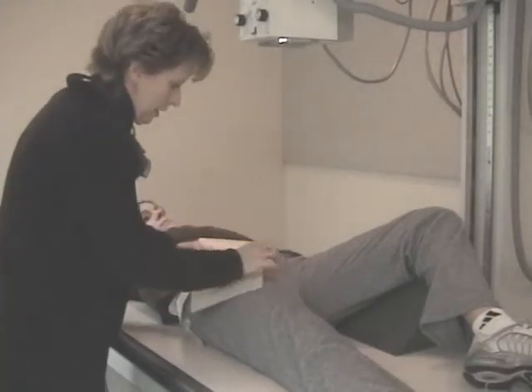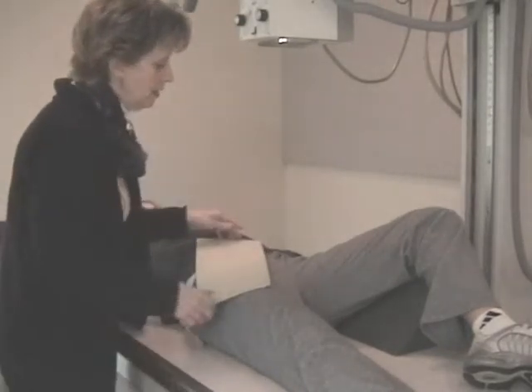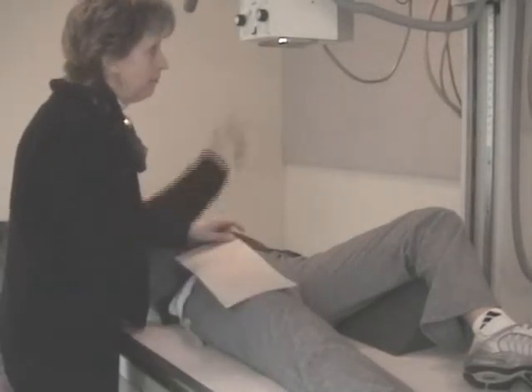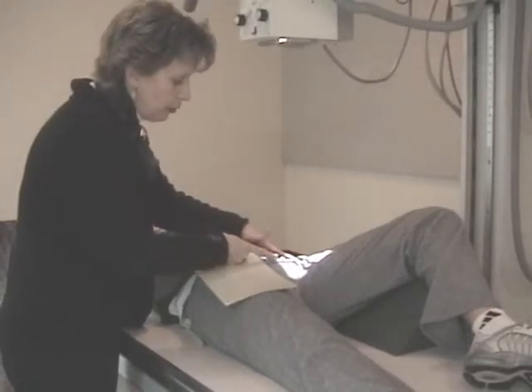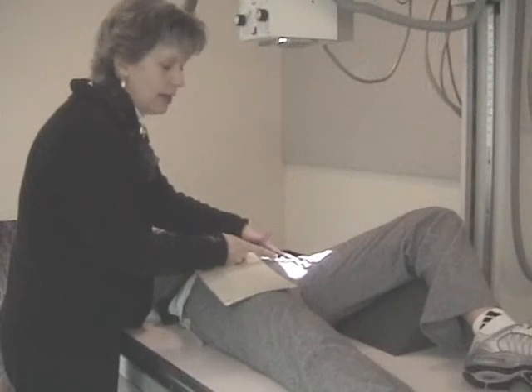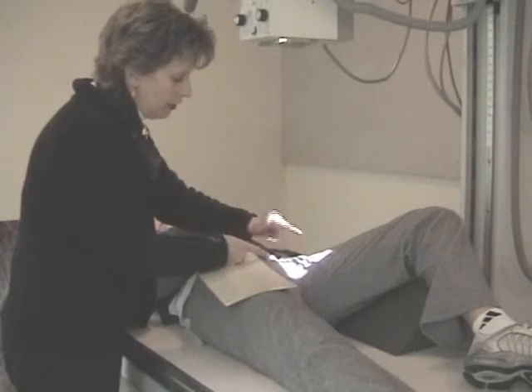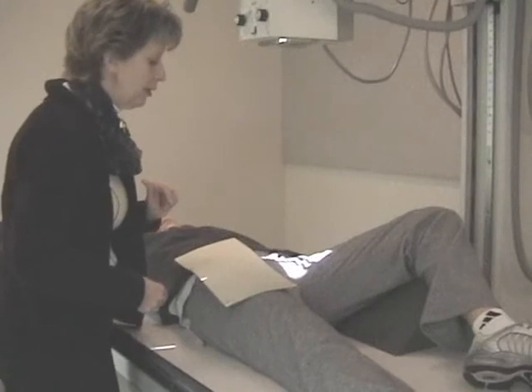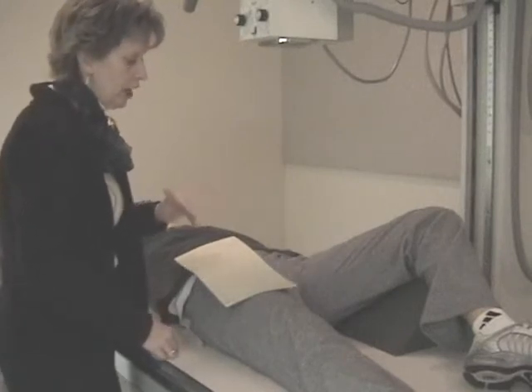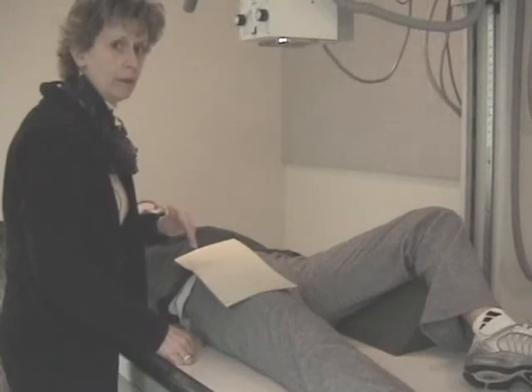Okay. And again, the leg is at 45 degrees. You're shielding one half. You use the ASIS and the upper border of the pubic bone. Make sure you recognize upper border. Imaginary line. Divide that line in half, go perpendicular, and that will be to the center of your film. Have an L marker on there. If you've done a good job of positioning this, the greater and the lesser trochanter will be superimposed.